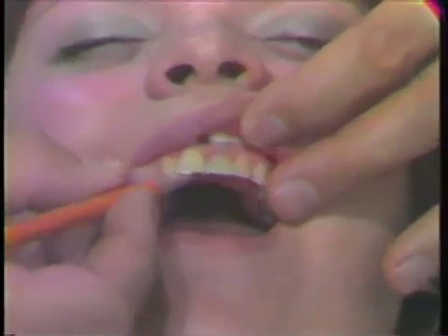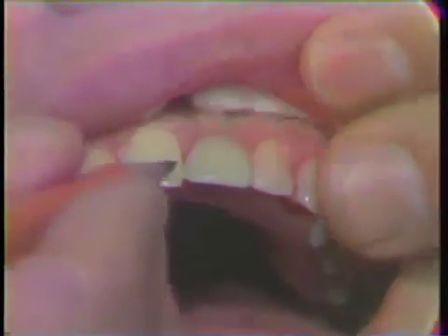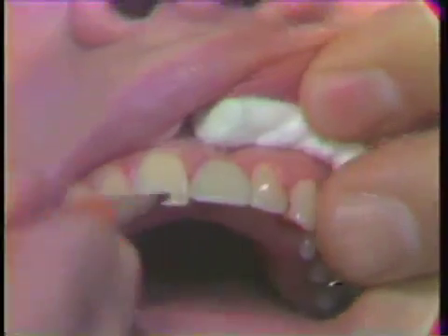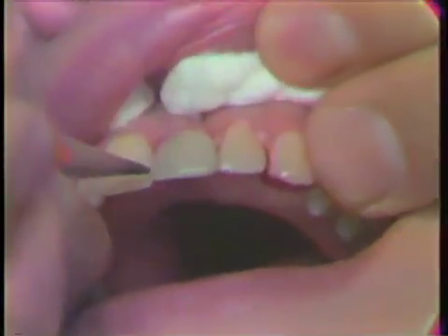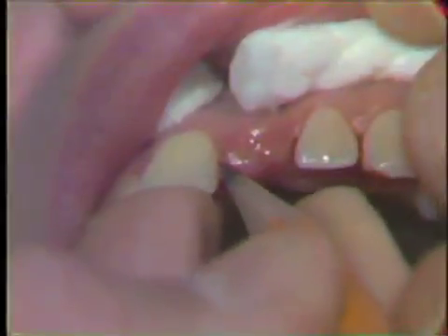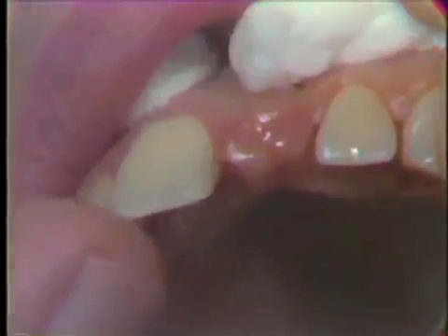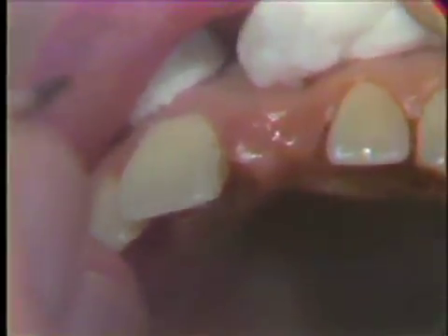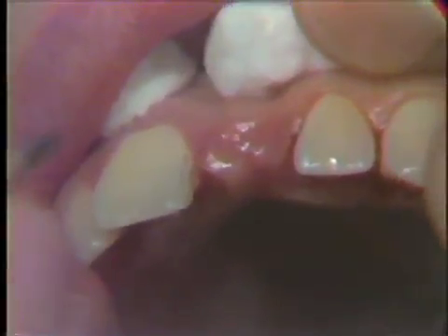We are going to prepare a three-unit pinledge bridge on this patient. The existing temporary partial will be used to establish the finishing lines on the central and the lateral incisor. We make a pencil mark on the central and the lateral. The purpose of this is to establish a finishing line on the labial extent of our slice that is far enough out so that the patient can clean this margin with a toothbrush, but not too far out that it's going to display a lot of gold.